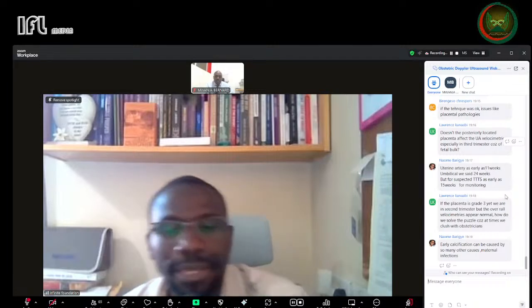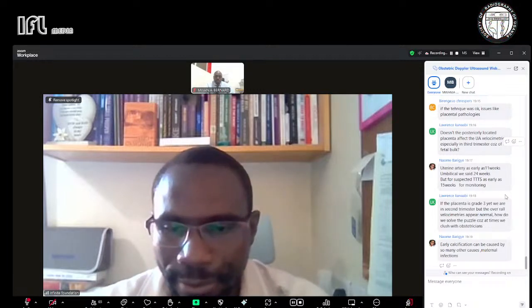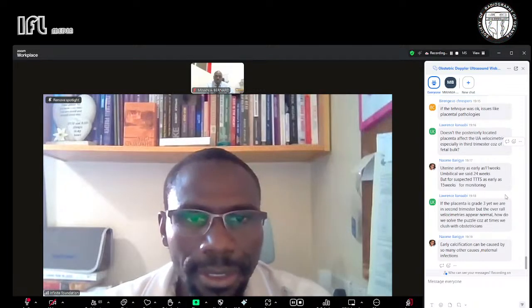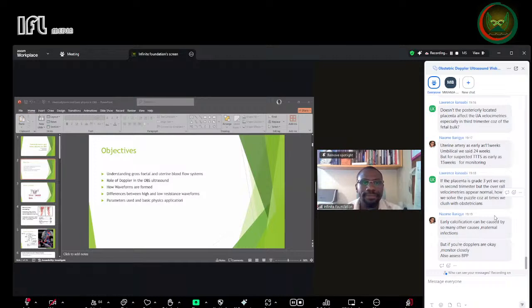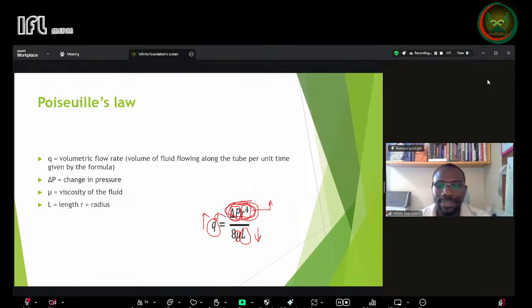I think it may be because of the distance. If I go back to my slides, let me show you something. When we are talking about the flow, we talk about the distance. And the distance, if you see here, there is L, which is the length of the vessel.